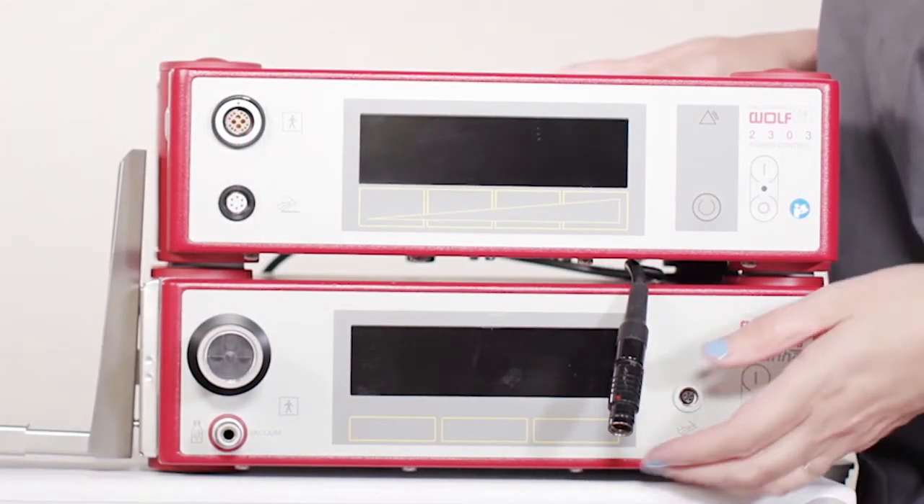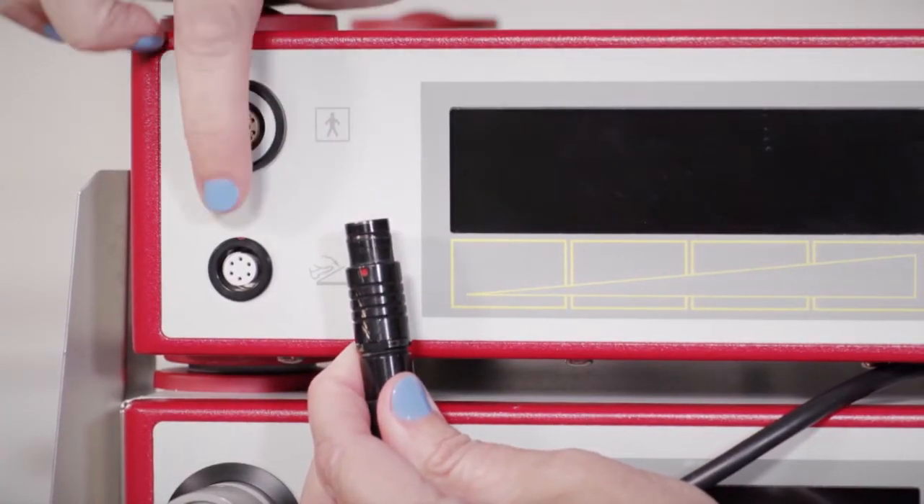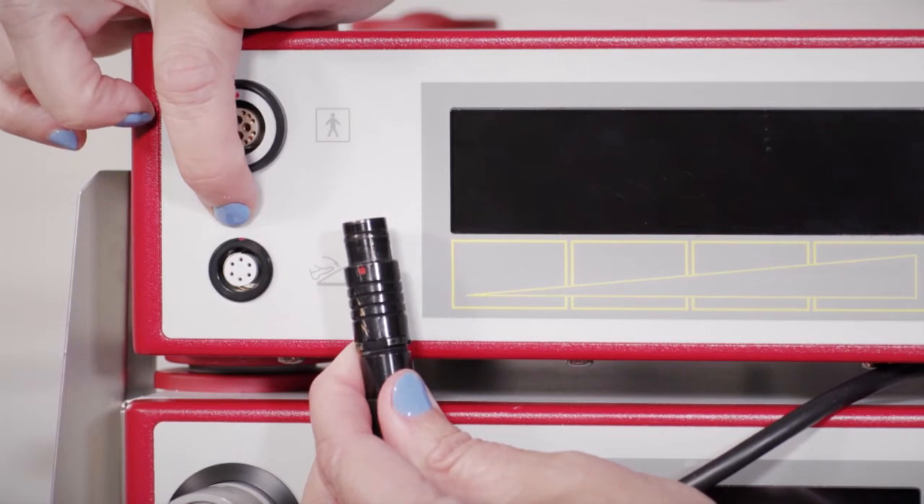Moving on to the front of the unit, attach the connection cable to the motor unit by aligning the red dot on the cable to the red dot on the motor unit connection cable port.